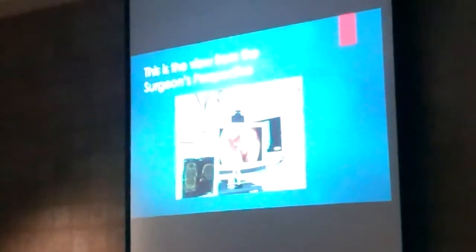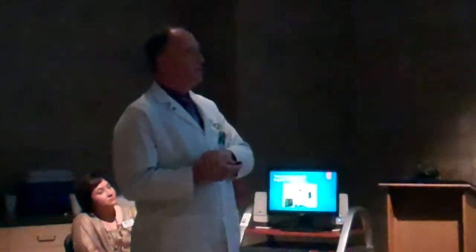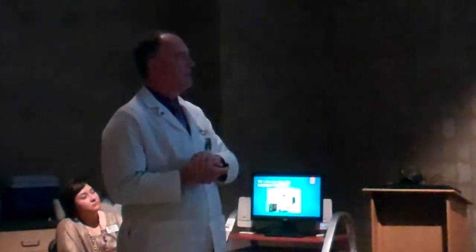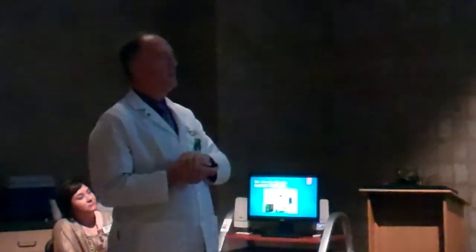And this shows me where the tip of this instrument is, and it's a little unclear here, but these two cross marks show me how far back we are on this one. So that's a side view or sagittal. It shows me how far I am left and right, and that's this one here. And then that's the view that I showed you before. It looks like we're looking at the face. And then on this cut, it slices through from top to bottom, and it shows me the anatomy from that view. And so we're right at the sphenoid sinus, and we're going to be taking some stuff out.